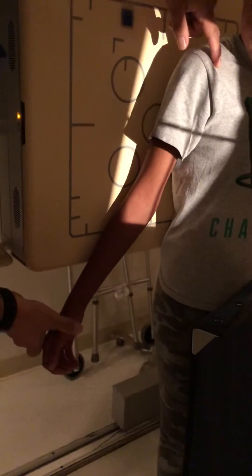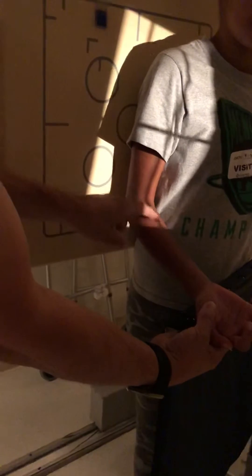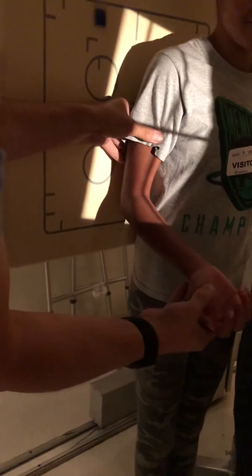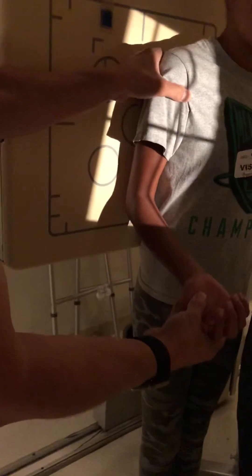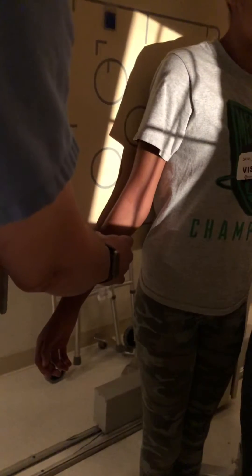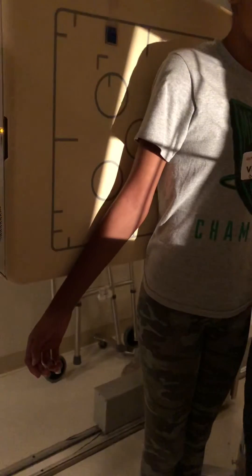A very good way to figure out how to do that is just to bend the arm and find out where the shadow goes right down the middle of the forearm. This is a true AP right here. This is obliqued, so you don't want that. Once you get it going down here, just let go, come all the way down, and you will be able to shoot the x-ray. So that's the AP view.